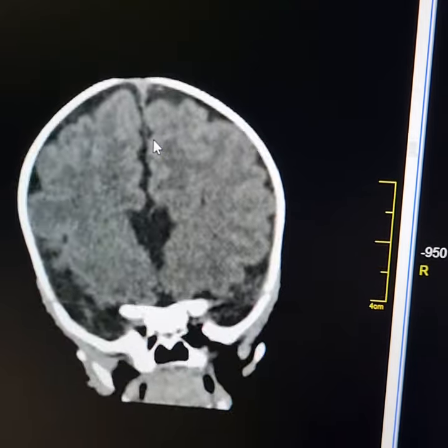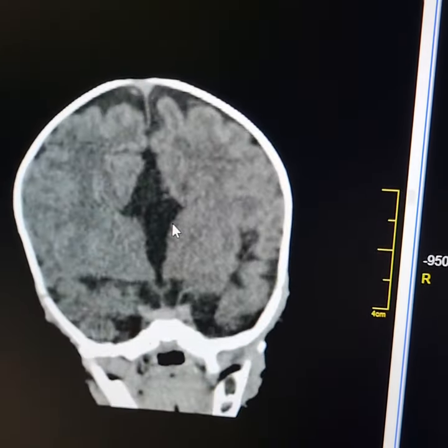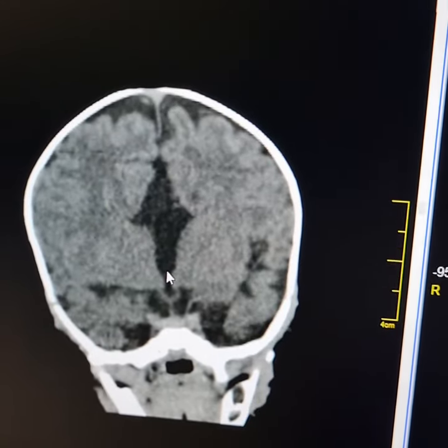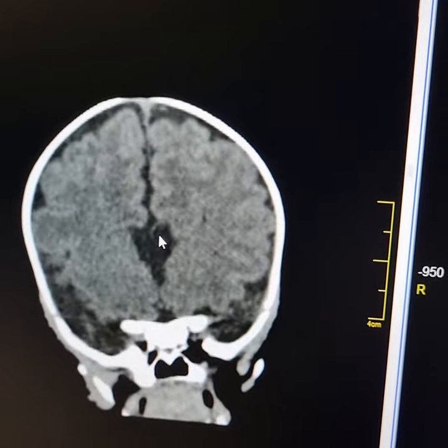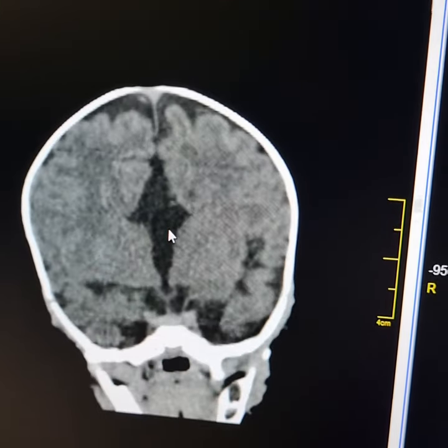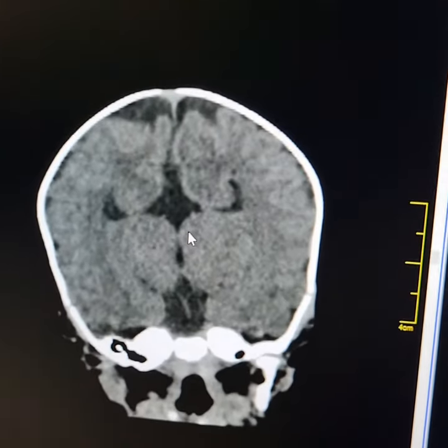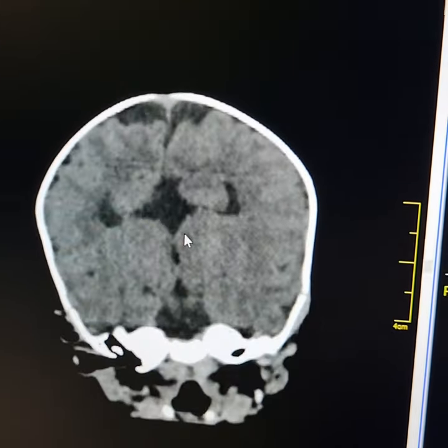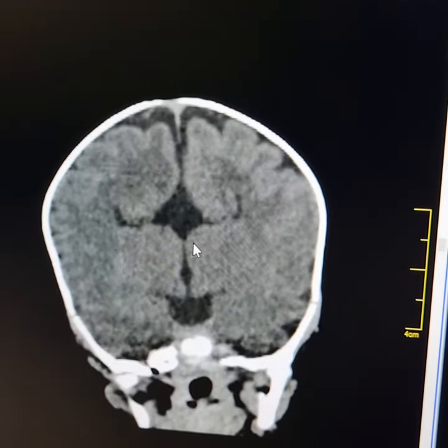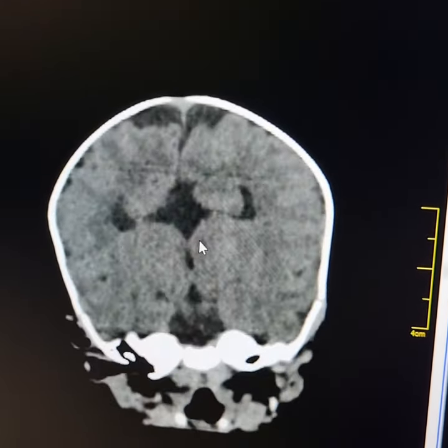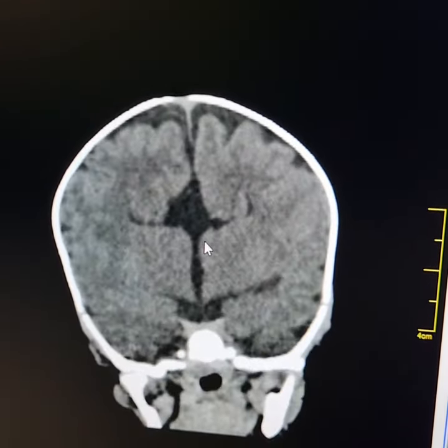You find separation of both the cerebral hemispheres. Midline structures are deficient. This is the third ventricle which extends upwards. So during antenatal ultrasound, any cystic structure lying in between both the cerebral hemispheres — please think of agenesis of corpus callosum as well, along with other such cystic structures like arachnoid cyst.